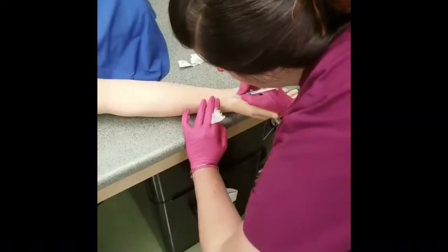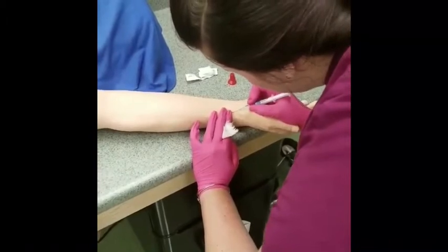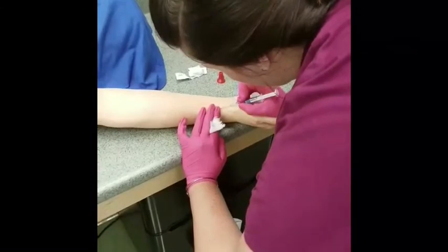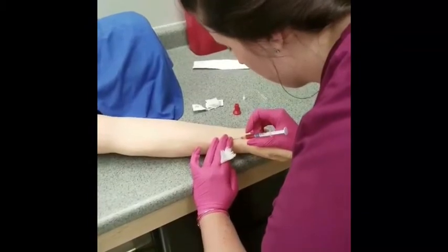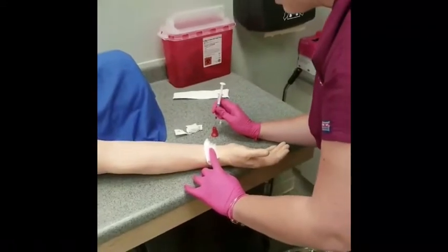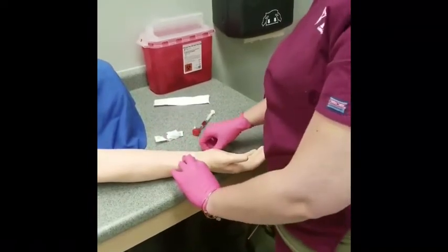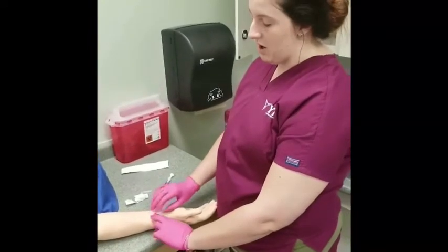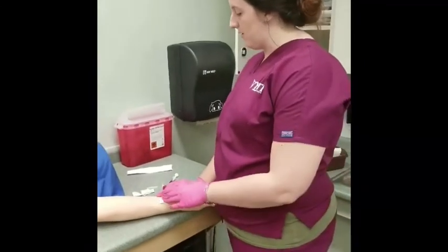And you're going to go in at a 45-degree angle, bevel up. And you're going to see a flash as soon as you hit the artery. And then you're going to watch it fill up itself. When you got it to where you want it, pull the needle out. Stick it there. Apply pressure until the bleeding stops. There's usually a band-aid that you can put over top, or just take tape and the gauze. Leave it on for about an hour, hour and a half, and then you can take it off.